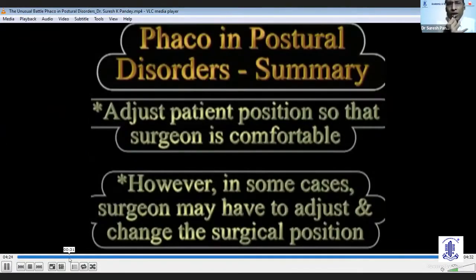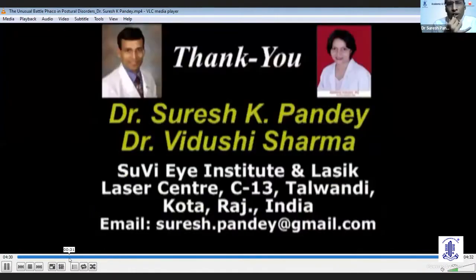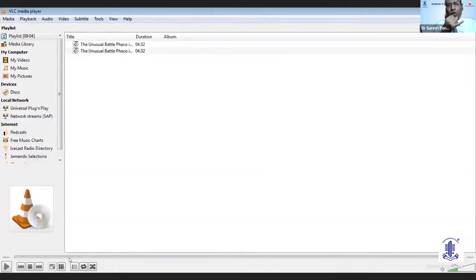We implanted a multifocal lens, and the patient regained 6/6 vision. It's a very difficult scenario. Sometimes we do encounter cases of phacoemulsification in postural disorders. It is very important to do a mock drill, explain the pros and cons, and then take these cases. Thank you very much.